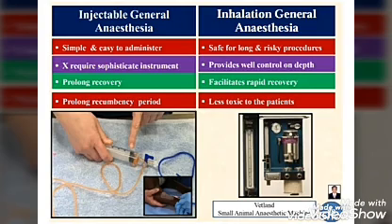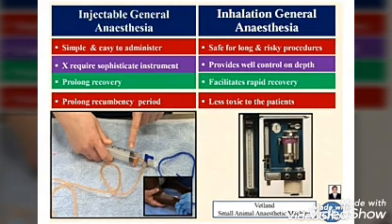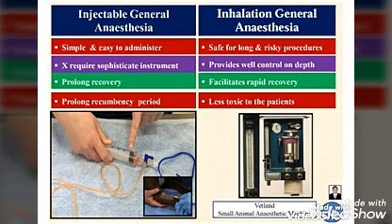It is a very sophisticated instrument, meaning a complicated circuit is there. So awareness about this instrument is very important regarding the use of inhalation anesthetic machines, and constant monitoring of the patients is required, by skilled persons. So constant monitoring of the patients and constant monitoring of the inhalation anesthetic machines.